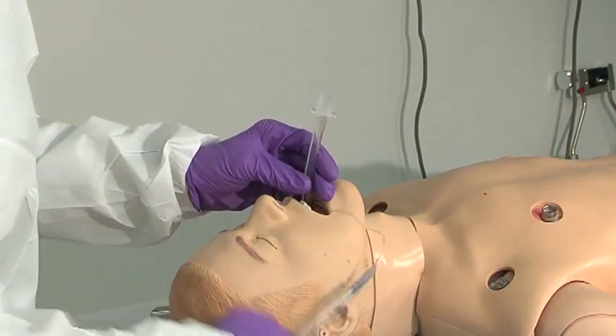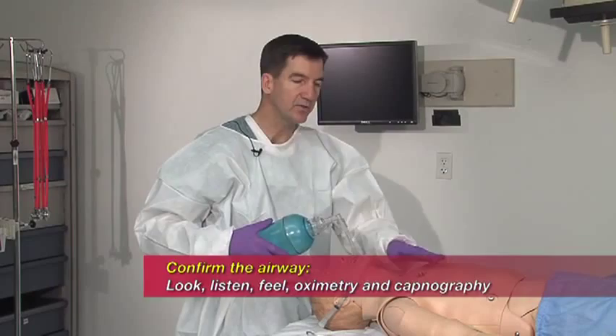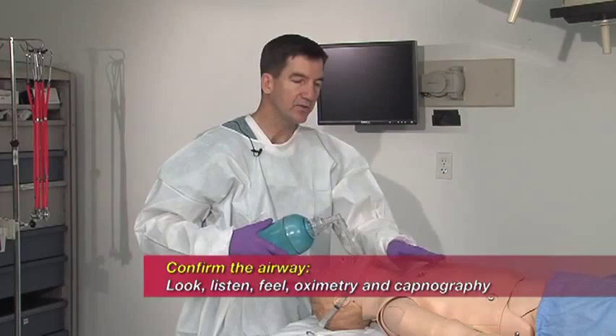Your bougie comes out. You inflate your cuff. Start bagging, watching for rise and fall of the chest, and listening for lung sounds on both sides.